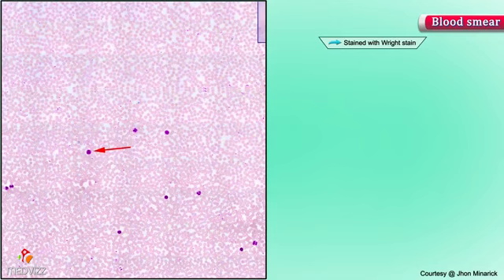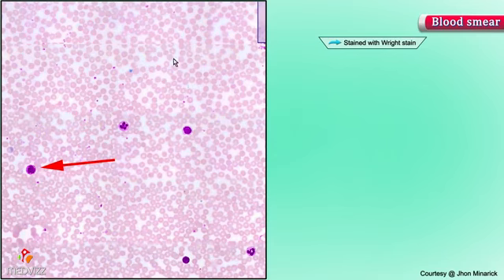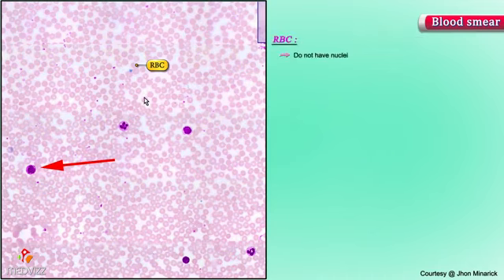There are several different types of cells classically on a blood smear. The overwhelmingly most common type of cell are the small, round, red cells with slightly lighter cytoplasm centrally. They do not have nuclei. These are red blood cells. There's about 5 million of these per cubic millimeter of your blood. The white cells are only about 1,000th as common. They're only about 5 to, let's say, 10,000 per cubic millimeter.